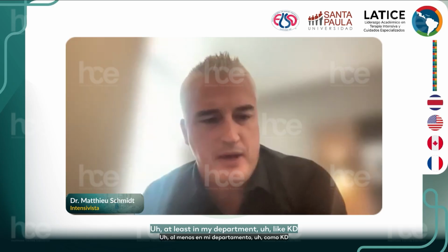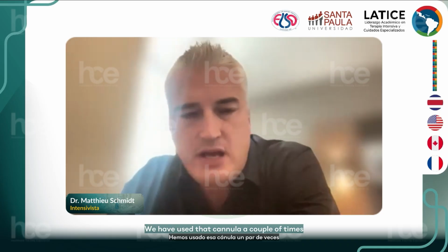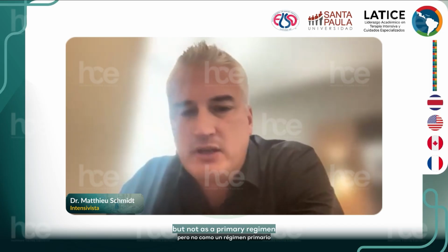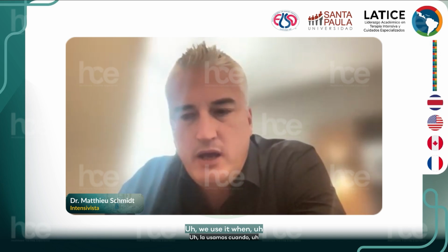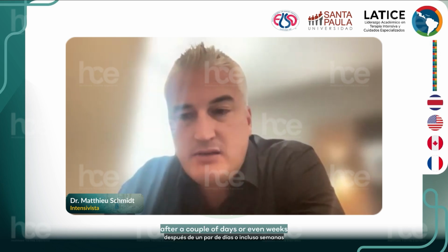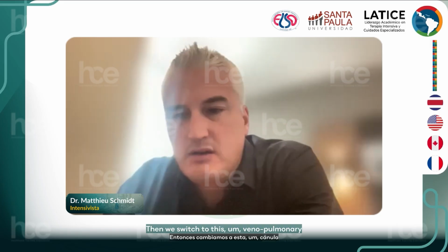I'm not sure if Kara or Matthew have any different experience or observations about this cannula. At least in my department, we have a small experience. We have used that cannula a couple of times, especially during COVID-19, but not as a primary strategy. We use it when, after a couple of days or even weeks, the patient has a very severe RV dysfunction refractory to inotropes. Then we switch to this venopulmonary artery cannula.